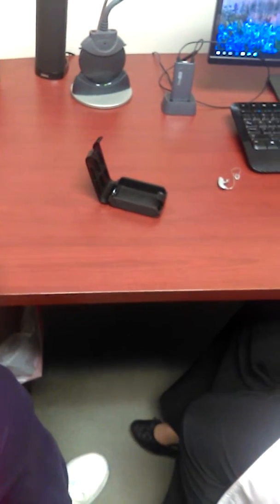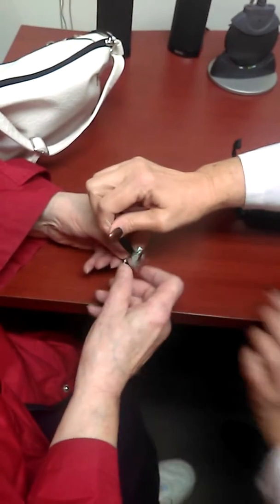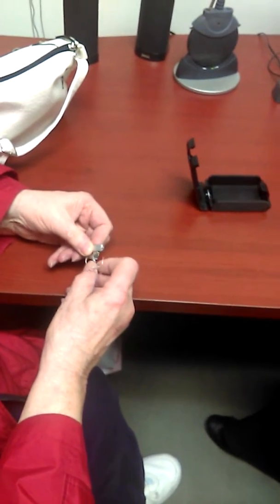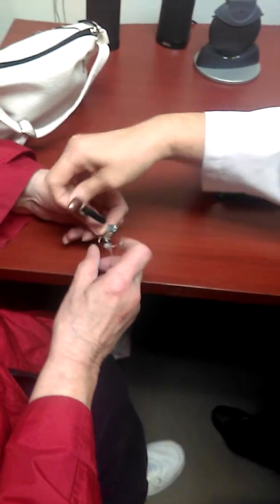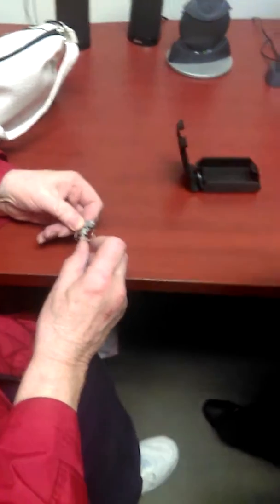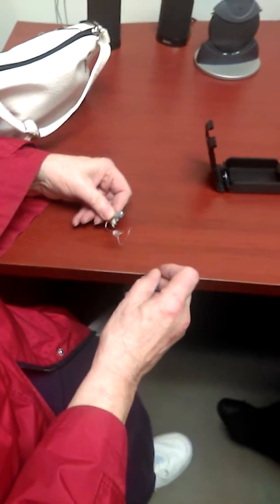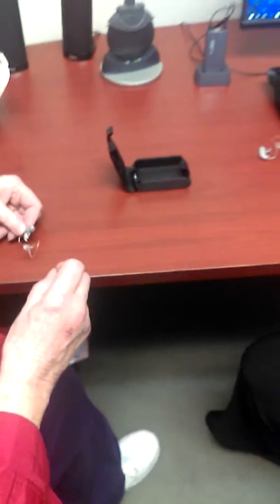You have one of these at home. I don't use it ever. Well, it's easier if you go like this. I have one like this. You put the battery in right there and you slide that out. Do you want to practice? Do you know where that is at home, Camille? No. I'll help find it for you when we go home. It's probably in a black box. In her black? Not that one. Okay, it's a bigger black box.